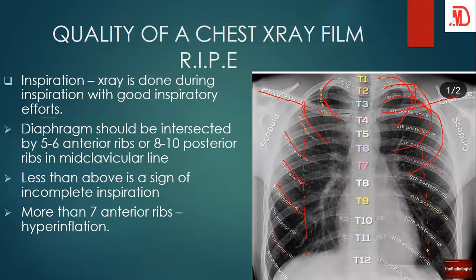Very beautiful. So this is how to differentiate between the anterior ribs and the posterior ribs. This one was anterior, so this is the posterior. Basically, when you inspire, the posterior ribs will go upwards and outwards. Up, out. That's how I used to know which one is anterior and which is posterior. And of course, the opposite will be true for the anterior ribs.